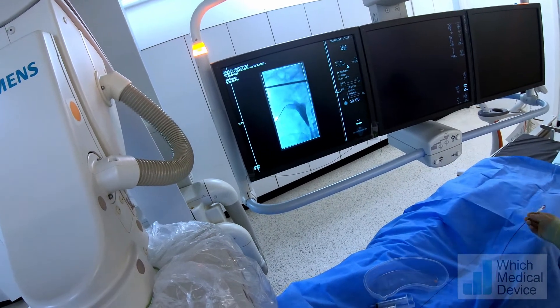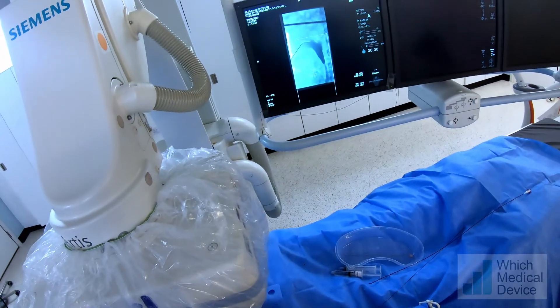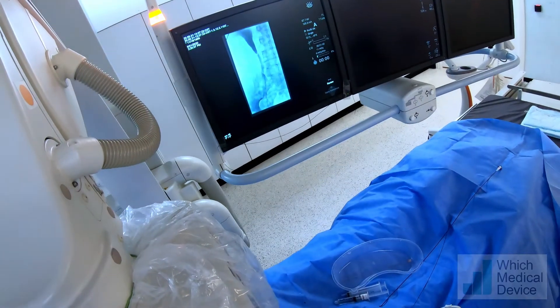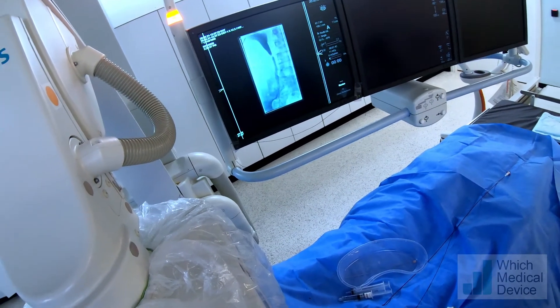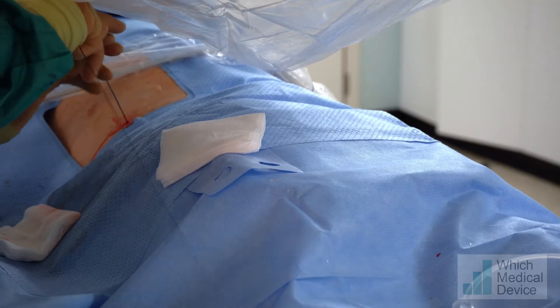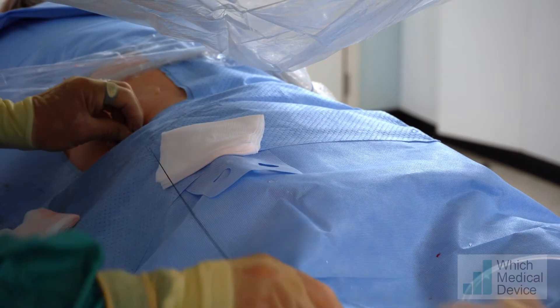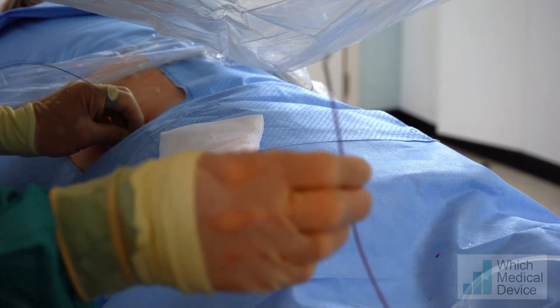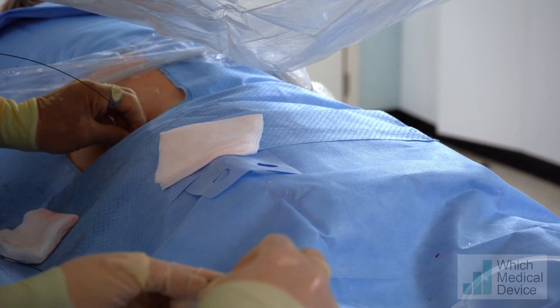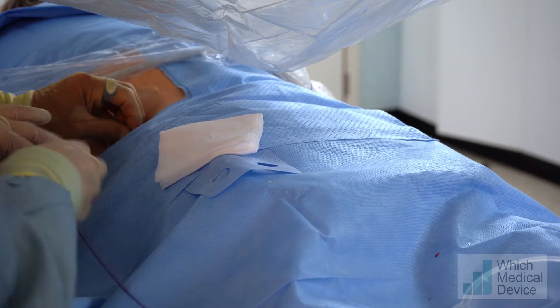The hydrophilic wire is now going down the ureter — it's just straightened the ureter out and we're going to take it right the way down to try and get to the bladder. We're then going to take our needle out and pop an angled catheter on. This is a Vector 2 or Vanshee 2, very similar to a biliary catheter but slightly longer. This will hopefully give us a little bit of angle to get past any distal ureteric occlusion.